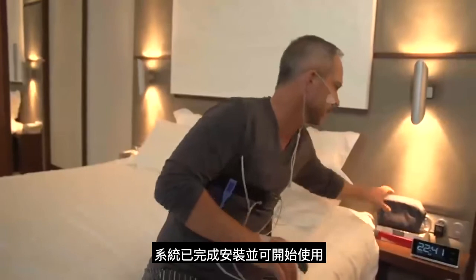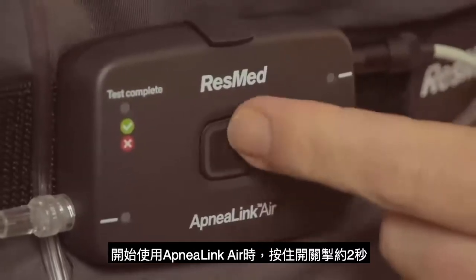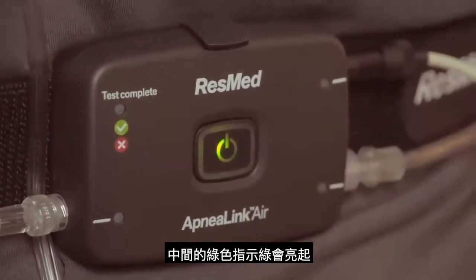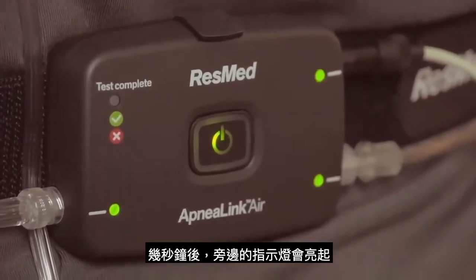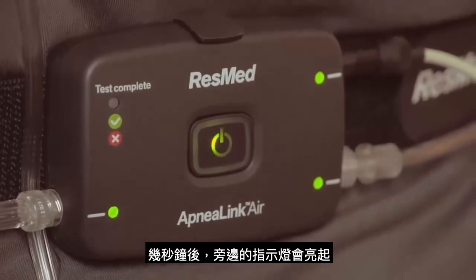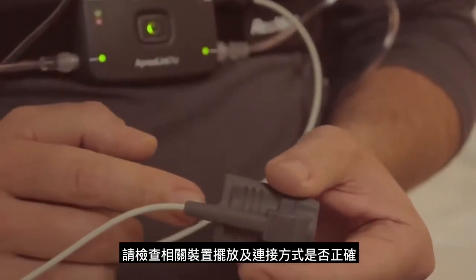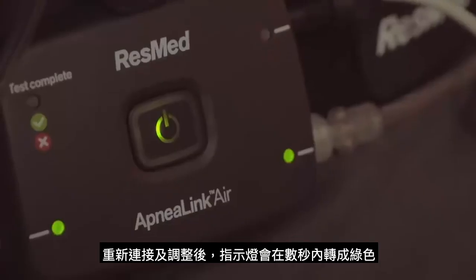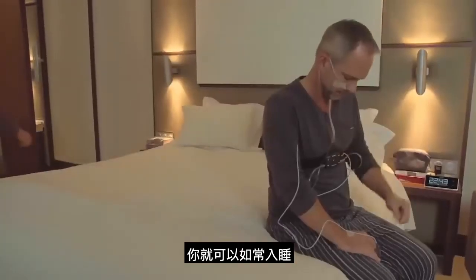The system is now fully assembled and ready to start recording. Start the ApneaLink Air by pressing the on/off button for two seconds. The central green light will illuminate and will dim automatically after 10 minutes. After a few seconds, the small lights on the sides will illuminate. If any light blinks red, check that the accessory corresponding to the light is properly placed and connected. Once corrected, it will switch to green after a few seconds. When all lights are green, you can go to sleep as you would normally do.